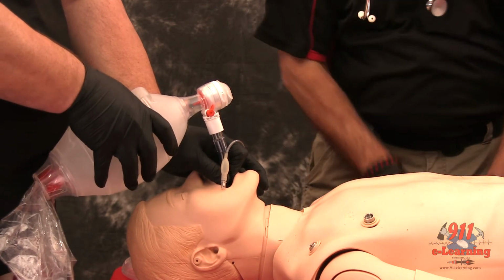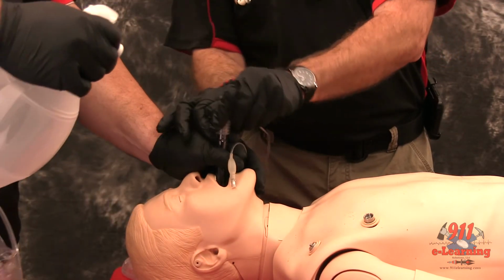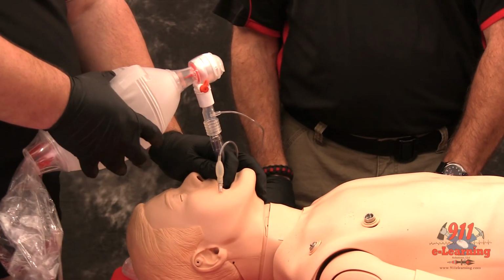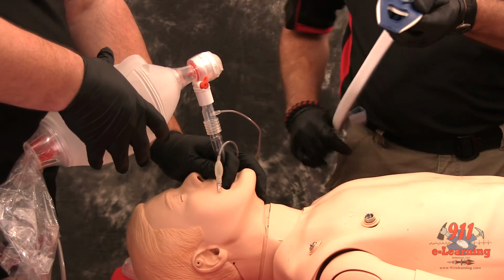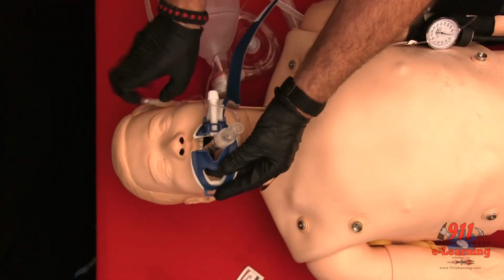Confirm tube placement using an end-tidal CO2 detector or esophageal bulb device. Monitor oxygen saturation with pulse oximetry and heart rhythm with ECG. It is strongly recommended that the airway, if equipment is available, be monitored continuously through capnography and pulse oximetry.